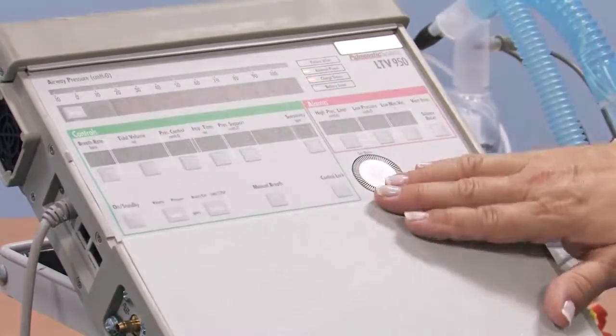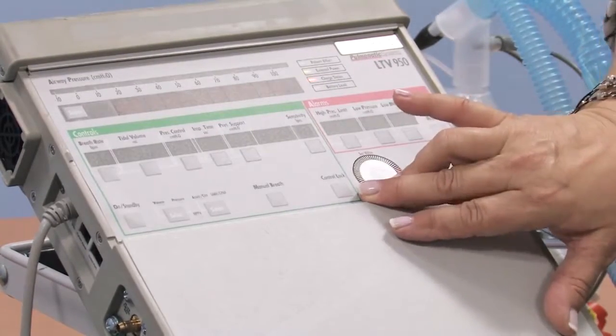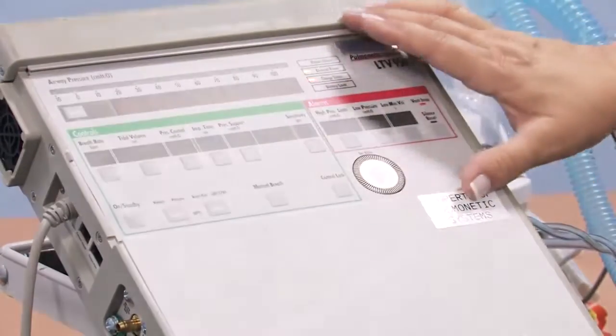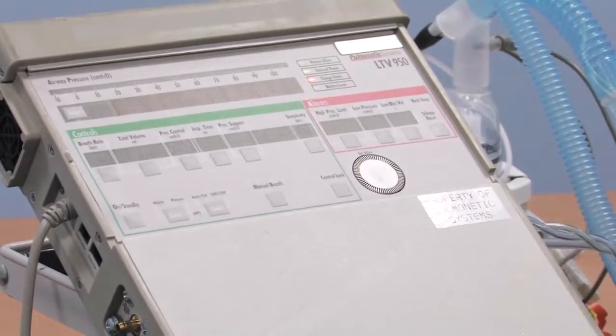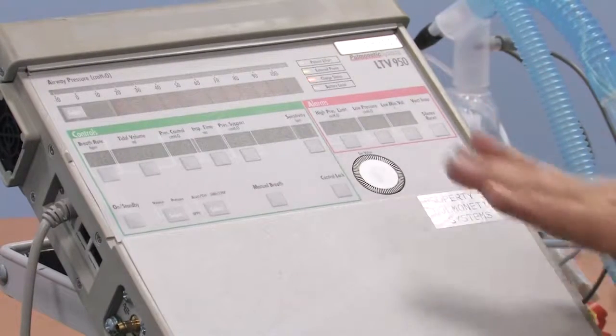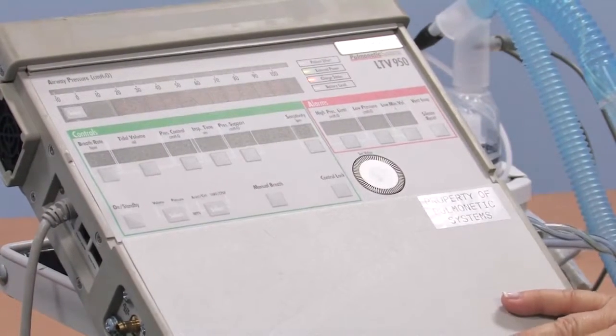All of these numbers can be locked, either with a short hold of the button or a long hold of the button. There also is a panel that can be slid across the top in case you have other little fingers in your house and you're worried about settings being changed. So there are things we can do to help protect the settings.